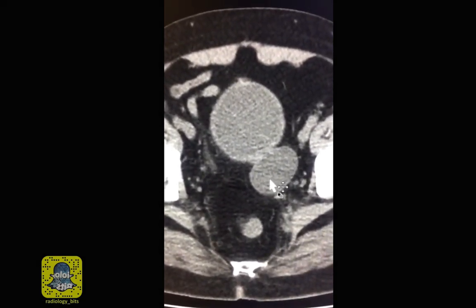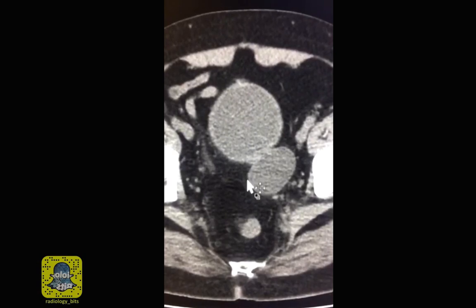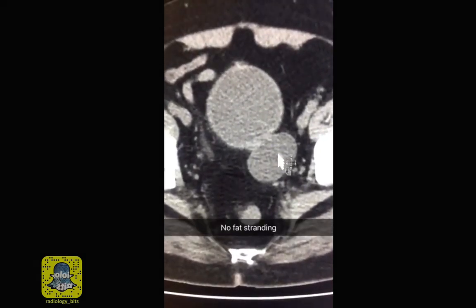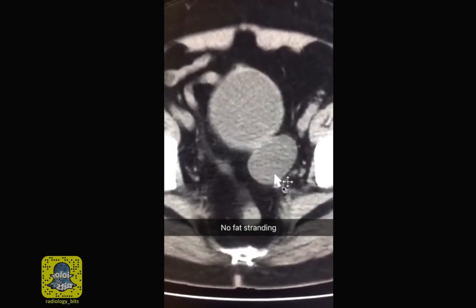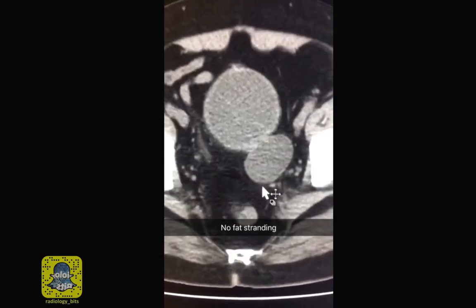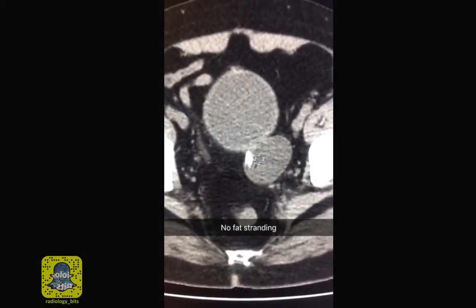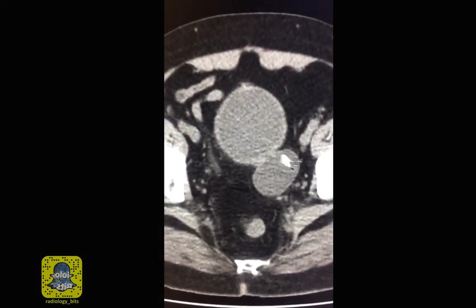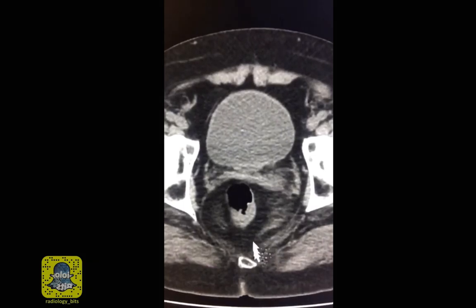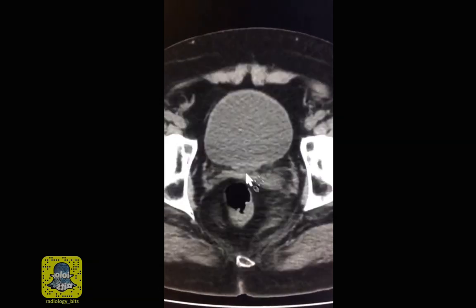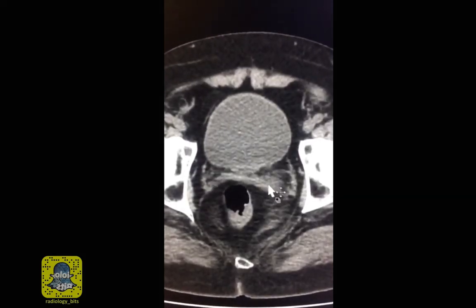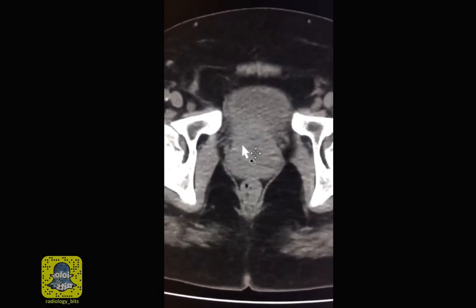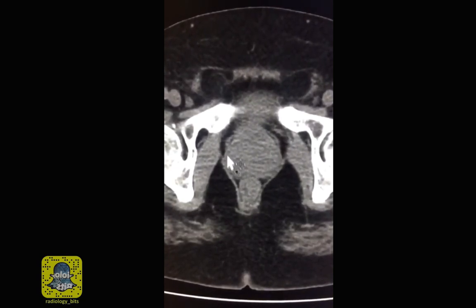The structure is extremely well defined and there are no surrounding changes within the fat. We learned from previous examples that clean fat is good, since fat stranding denotes inflammation — and this is not seen here. The lesion is far away from the colon, which is here. It's also far away from the seminal vesicles, and it's unrelated to the structure below the bladder, which is the prostate.